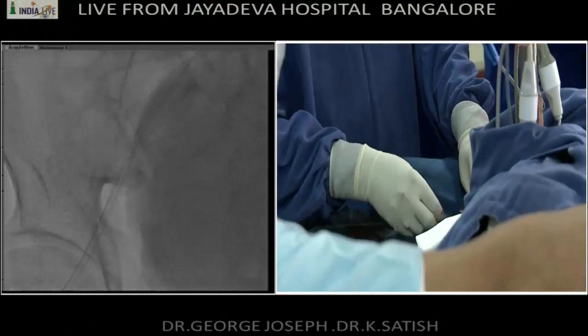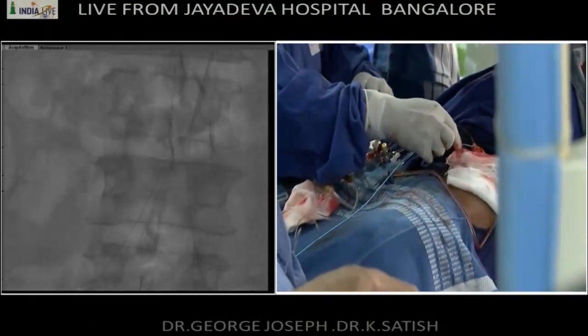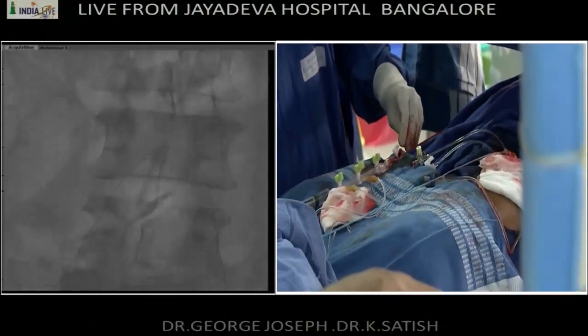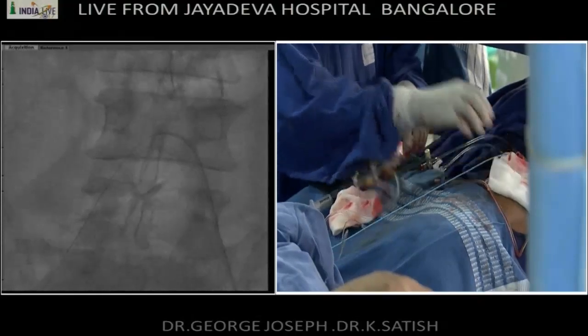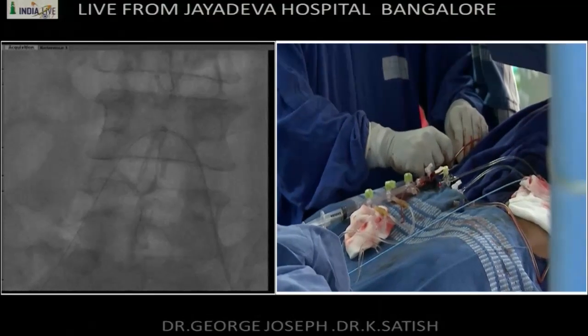Show the bifurcation area. Oh, it's buckling there. Okay. Yeah, hold it like that. I'll just hold the wire, please. Okay, now you feed in. I'll feed in the wire.